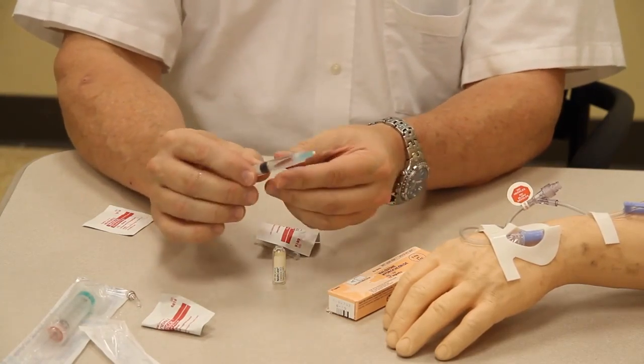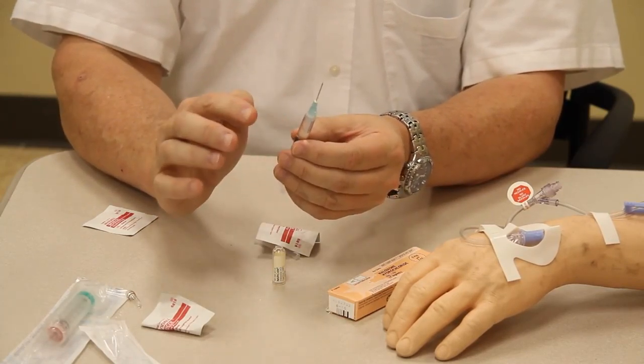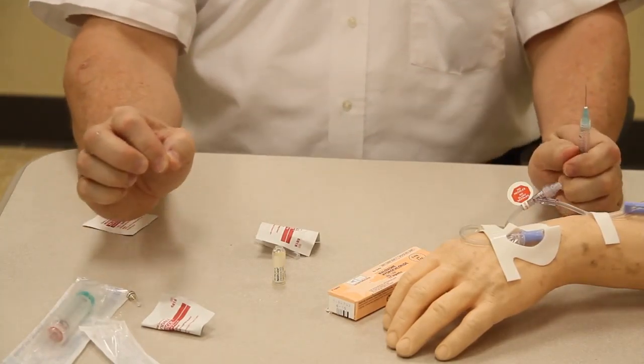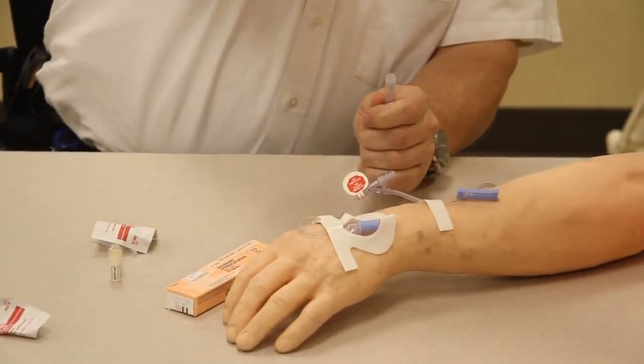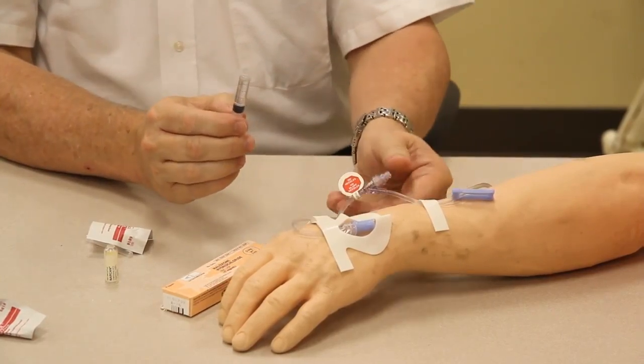The next thing I want to do is make sure that there's no air in my syringe. And then I'm not going to recap my needle. We don't recap needles. I'm going to actually take the needle, twist it, and put it into the sharps box.